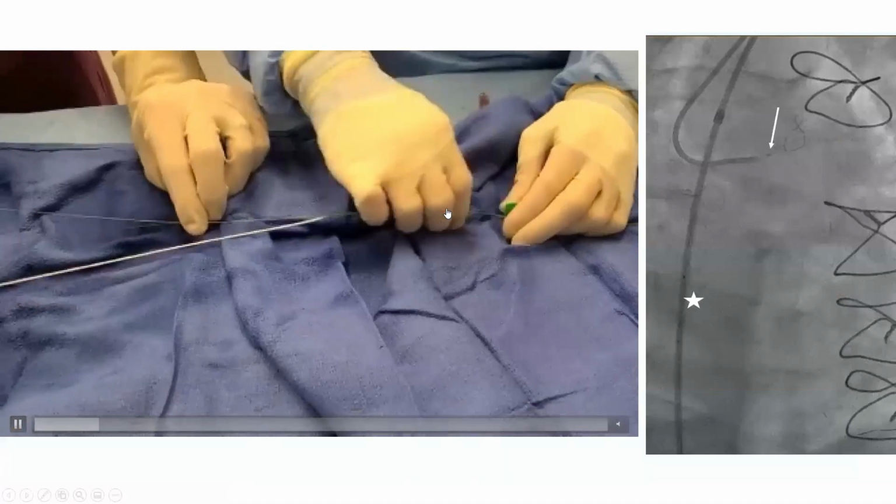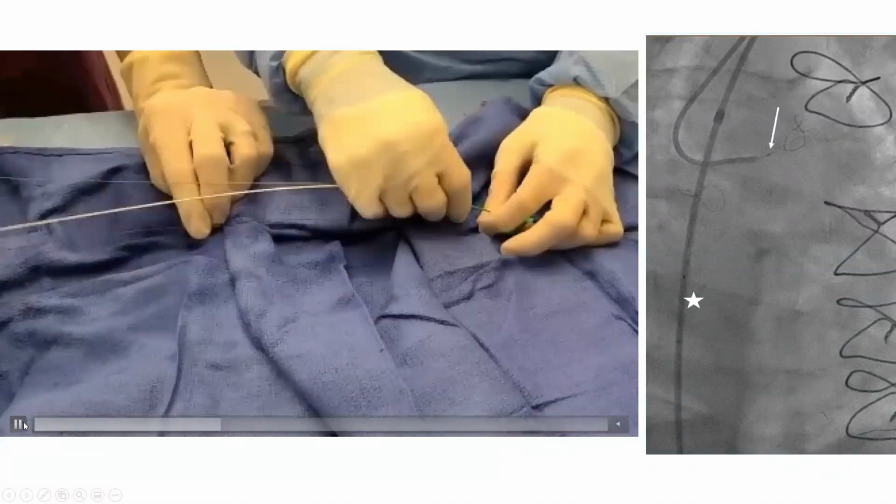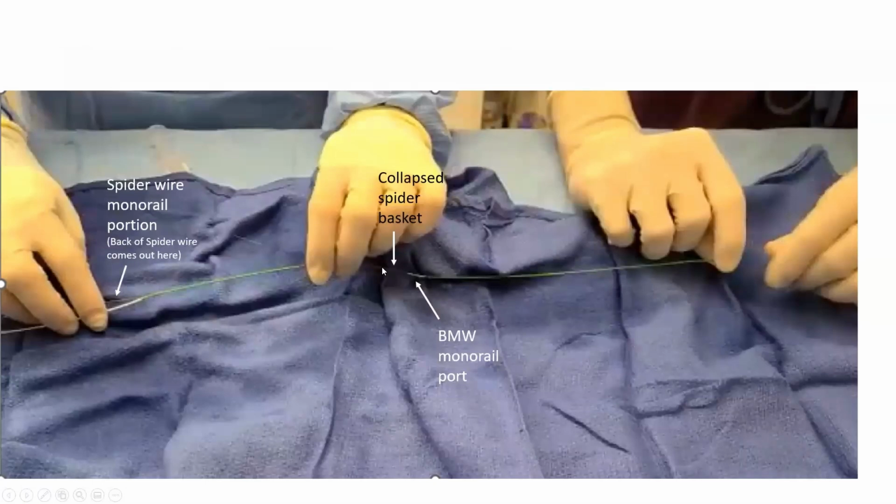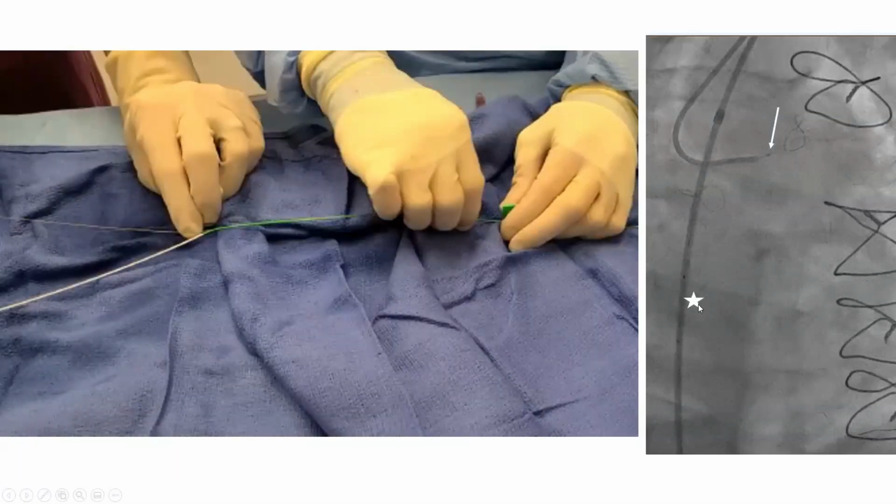Now you advance the green catheter over the BMW wire, and once you are past the BMW monorail portion, you're advancing, and now once you are over the monorail portion, you hold the BMW wire and you advance both the spider wire and the spider catheter simultaneously. Those are held in sync by your right hand, and they are pushed in sync. And as you are advancing over the BMW wire, at one point you will see the catheter tip at the tip of your guide on fluoro. And when your catheter tip is here, keep in mind that the collapsed basket is way back, around the star area here.